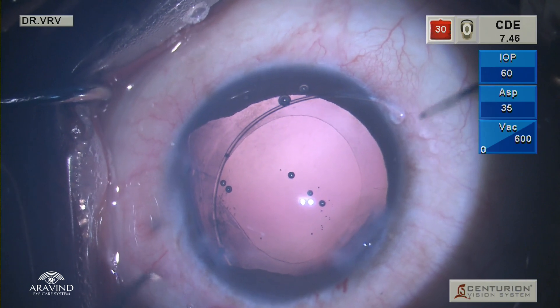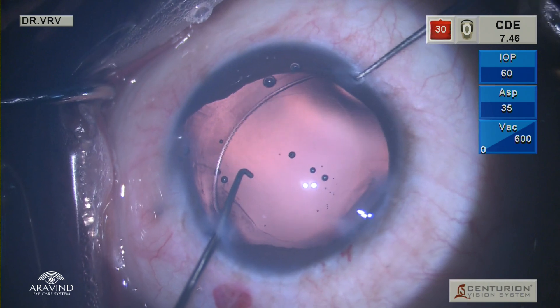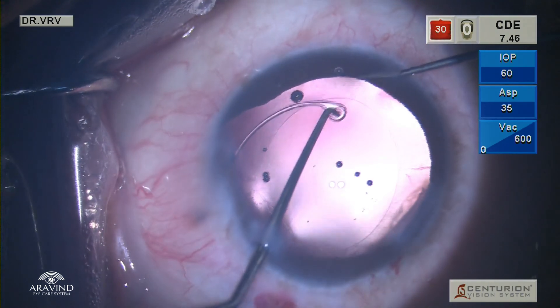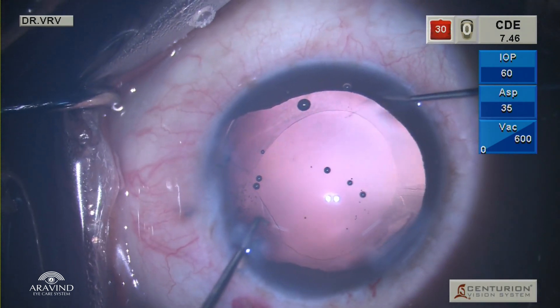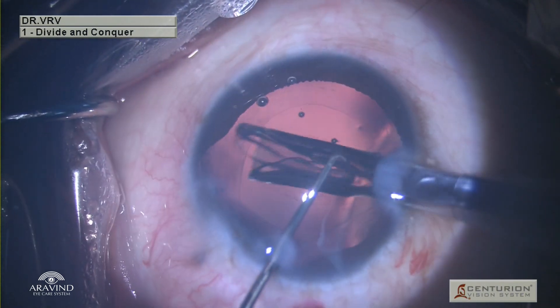The trailing eyelet is hooked using a Sinskey hook and gently brought into the anterior chamber. The second Sinskey hook is introduced through the paracentesis on the left side to make sure the trailing eyelet also goes into the capsular bag. Following which, a single-piece acrylic lens is injected into the bag.